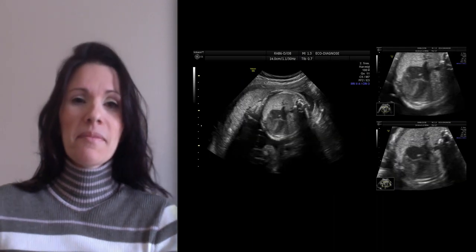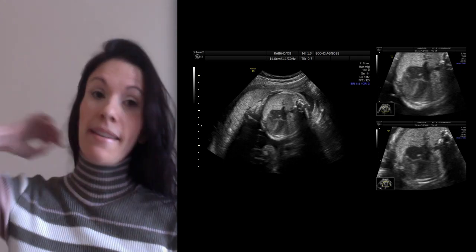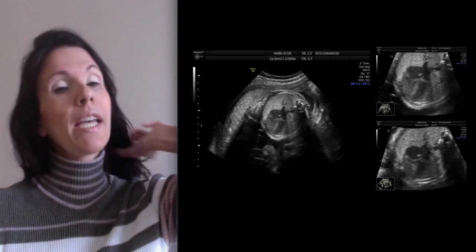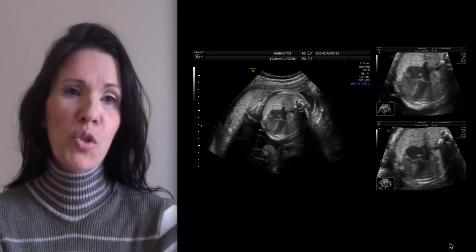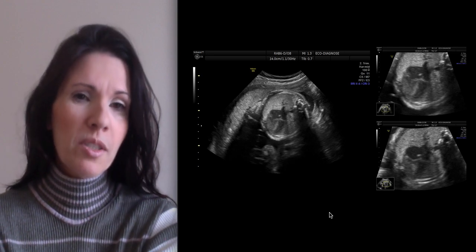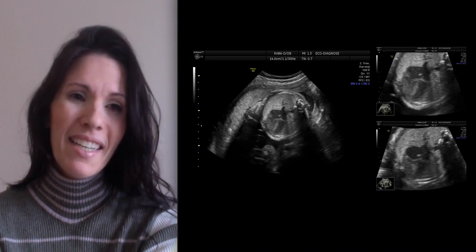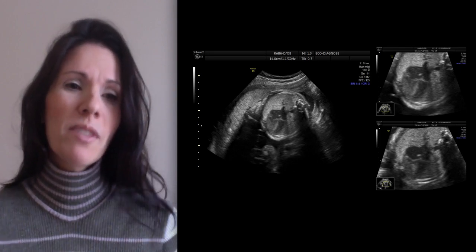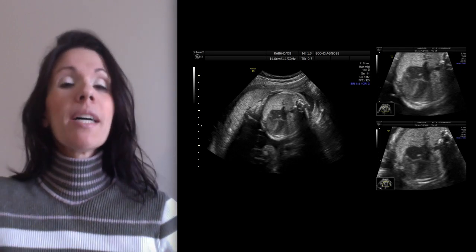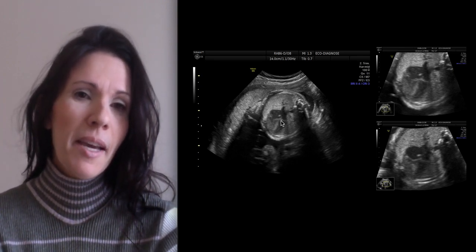And this one. I got this image yesterday, at 28 weeks gestation, and I saw this baby at 20 weeks as well, when I was in doubt. And yesterday, I was sure about the diagnosis. But yesterday, I saw this image and this gap.